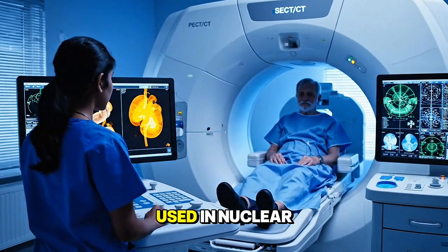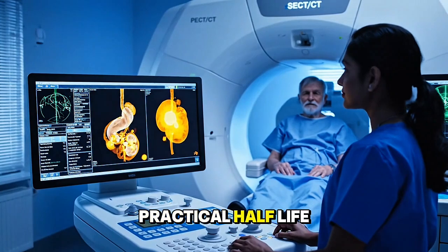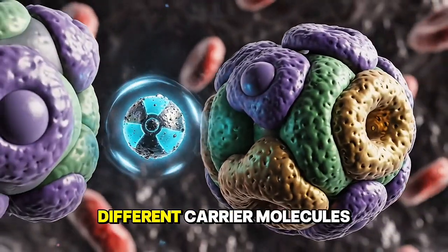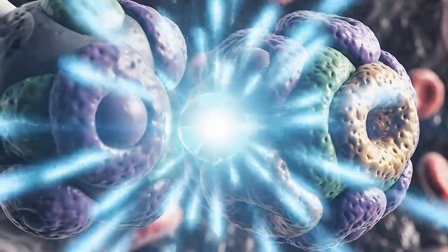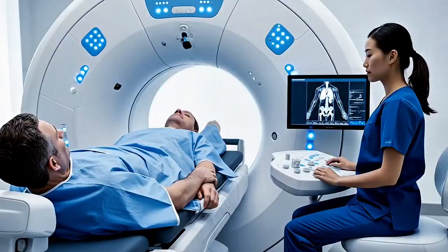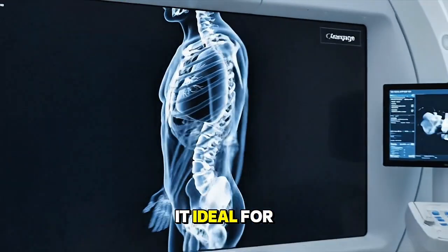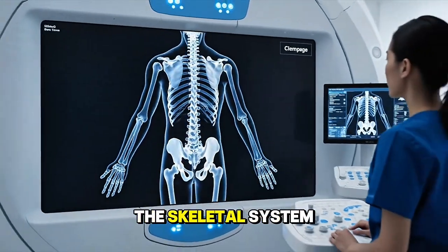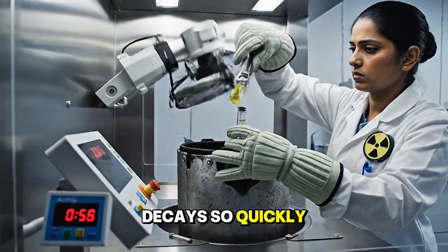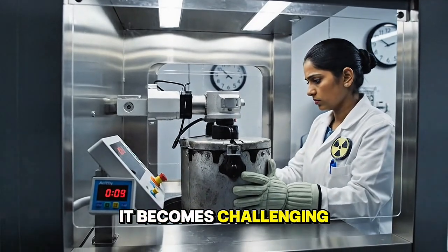Technetium is widely used in nuclear medicine because it has a short and practical half-life. It can easily bind to many different carrier molecules. It emits low-energy gamma rays. It is quickly cleared from the body. These properties make it ideal for imaging major organs and the skeletal system. However, because technetium decays so quickly, processing, transporting, storing, and dispensing it becomes challenging.